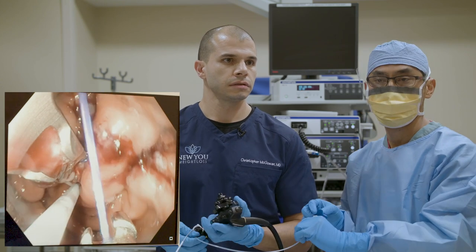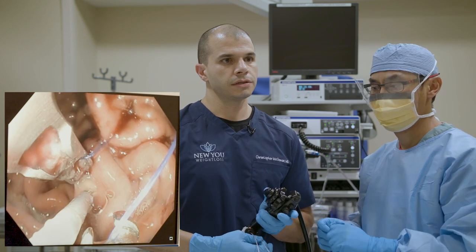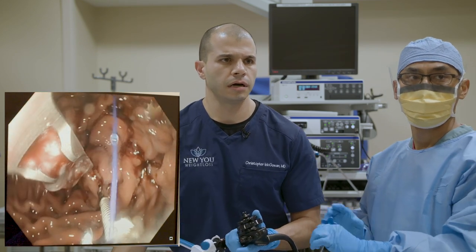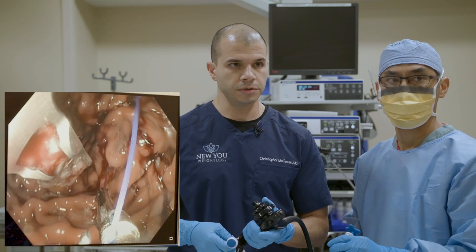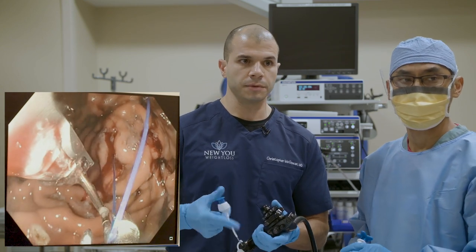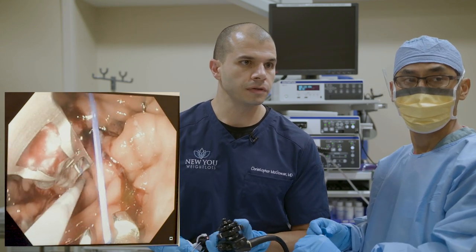Question from Keith: what is the pre-procedure diet for ESG and how many days before? We don't have a major requirement — we ask our patients to be on a liquid diet the day before, just to make sure their stomach is completely empty for the procedure. There isn't a liver reduction diet for two weeks leading up to this like you would have with a surgical procedure. So really pretty minimal.